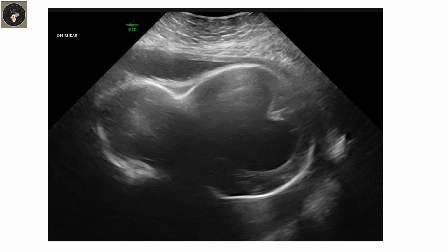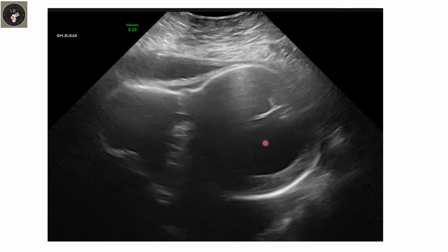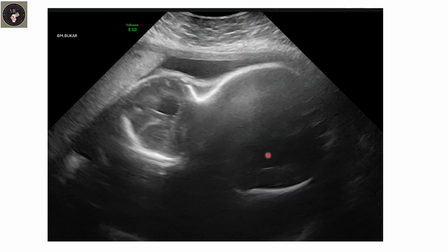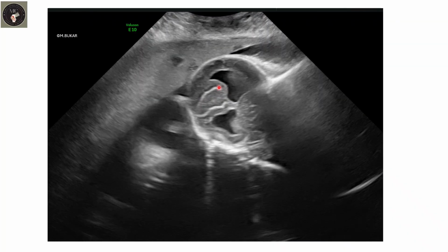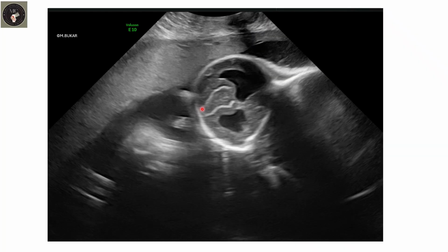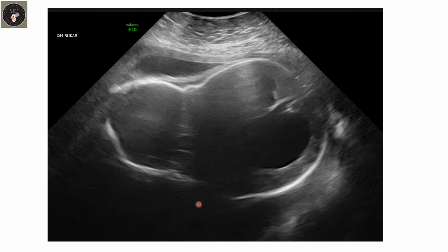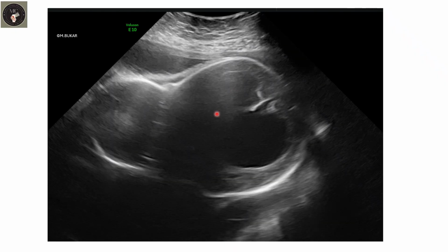So this is the video targeted to the fetal skull. You can see the appearance of the skull, the dilated lateral ventricles, dilated anterior horns here, bulging towards the ear, so towards the temporal region. So you can see this bulge here. You can see another bulge somewhere here, but the view is limited because of this extensive shadowing.